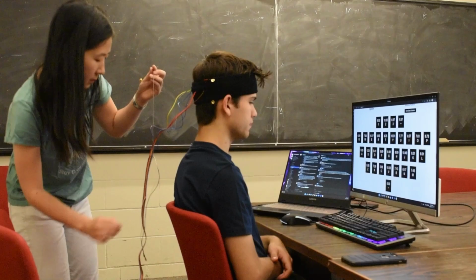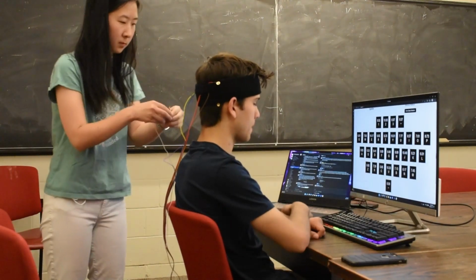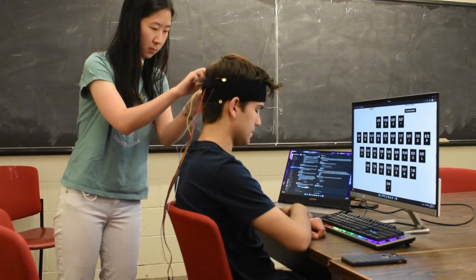We collected data from 11 university students, both male and female, using an 8-electrode setup on the occipital lobe of the participants. The positions of the electrodes were informed by our literature review and based on the 10-20 system. We ultimately chose to use the Oz, O1, O2, PO7, PO8, POz, PO3, and PO4 electrode placements.